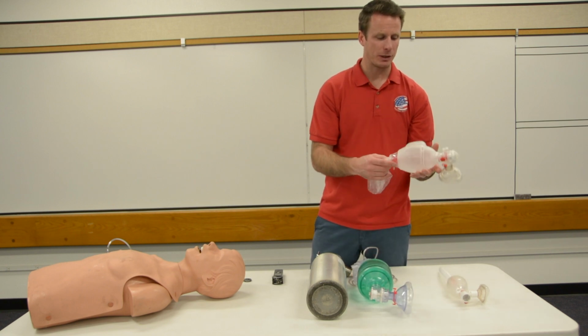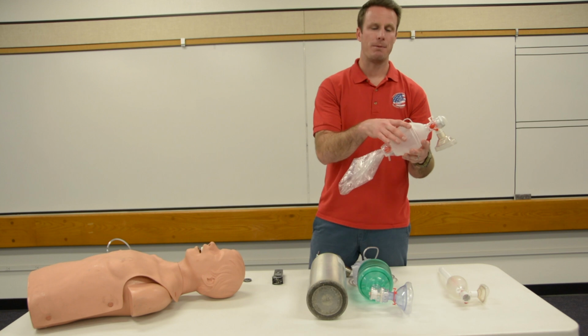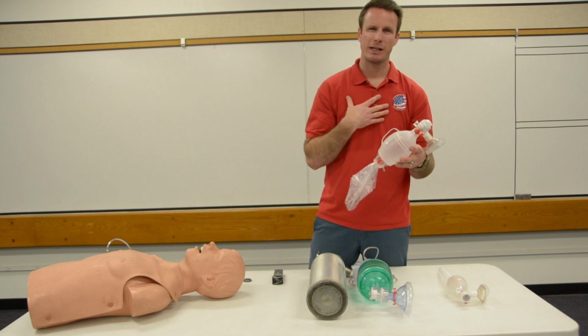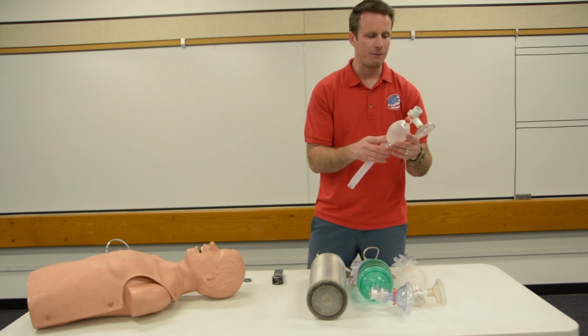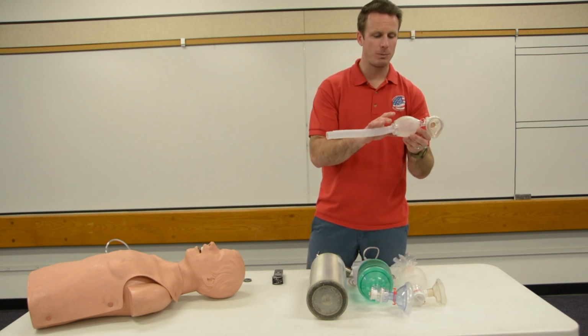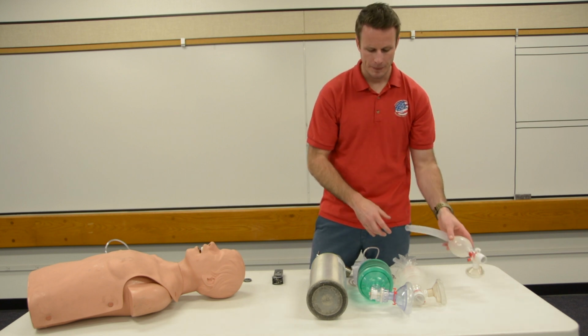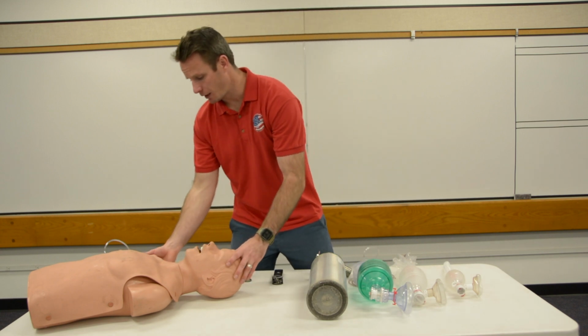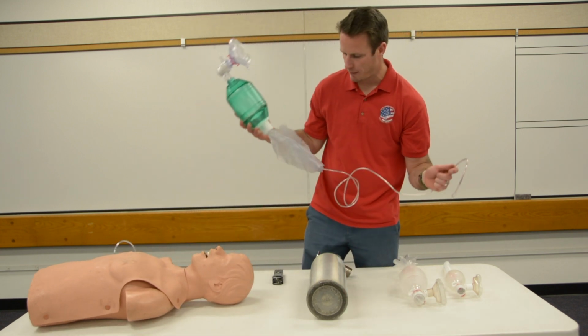This is a pediatric, or child, BVM. Again, you can see the mask is a little bit smaller. The bag is a little bit smaller because we don't want to overfill their lungs. And then here's our infant BVM. Again, the mask is even smaller, and the bag is even smaller, because we want to deliver even less breath to them. Now, my patient today is an adult patient, so I'm going to select the appropriate one, which is going to be the adult BVM.